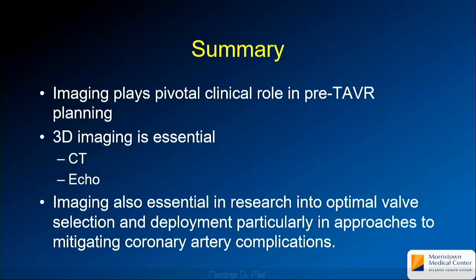In the interest of time, I couldn't really go into all the little measurements, especially if you're doing a valve-in-valve procedure. They're pretty granular, but you need to learn how to do those and to be on the lookout for patients who might benefit from a procedure that lacerates or cuts one of the coronary cusps.